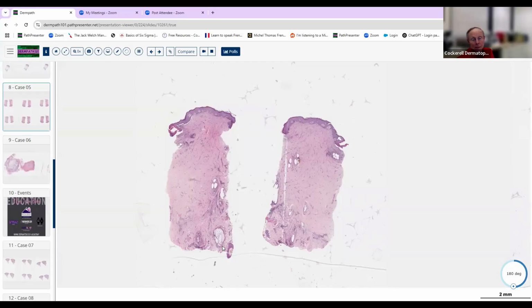Here we see hardly any. So we know we're dealing with, if it's a scalp, it's an alopecia. So when we're dealing with an alopecia, we have an algorithmic approach to how we approach an alopecia. Ask yourselves whether it's inflammatory or non-inflammatory.